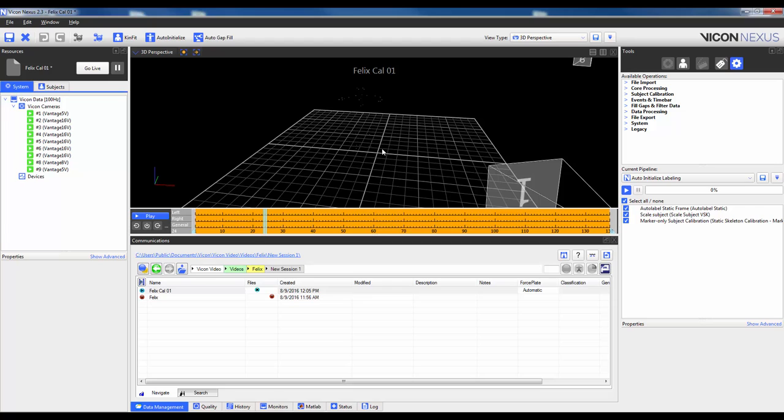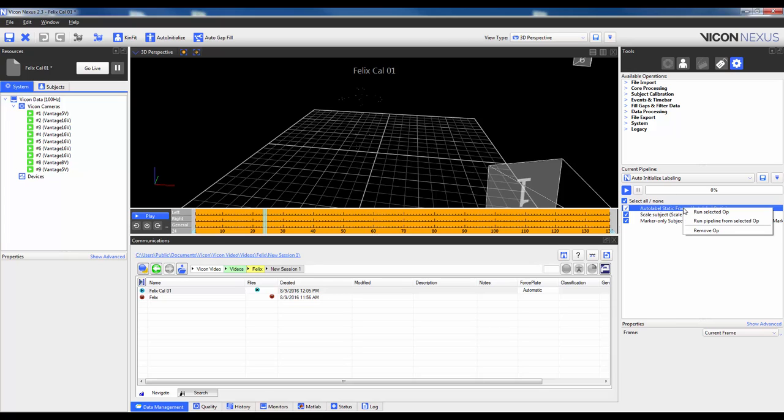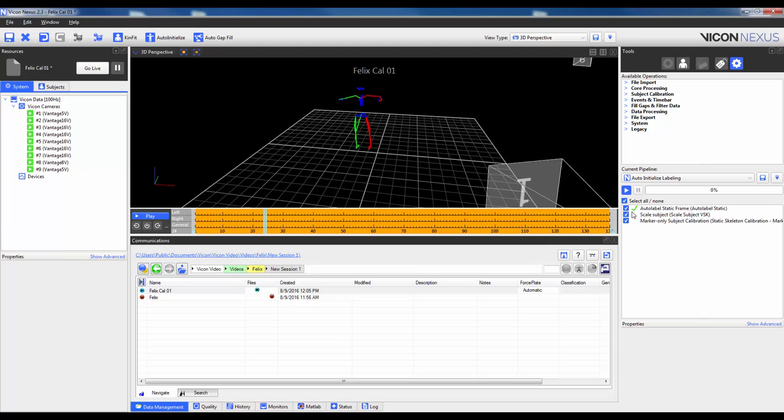Failure to comply with either of these two provisions will likely cause some incorrect labeling. You can always change the current frame and run this pipeline on a different one. To run this pipeline operation individually, I will right-click on it and select Run Selected Op. The green checkmark indicates that this pipeline operation was successful. If it was not, let's say due to a missing marker as an example, you would get a red X.